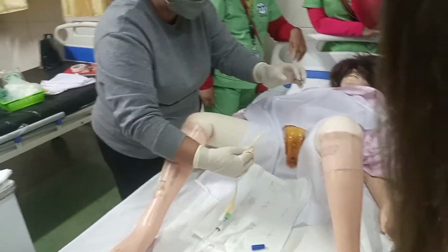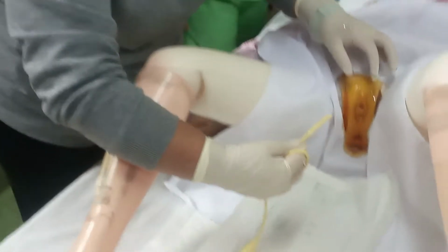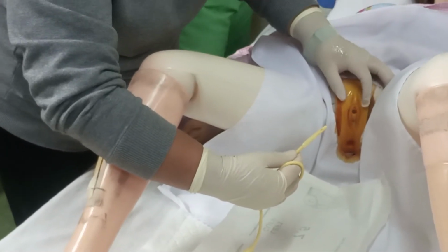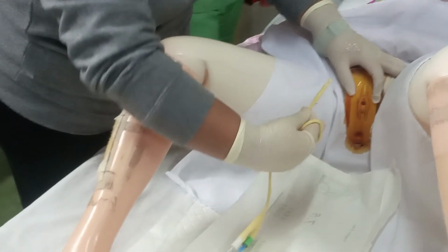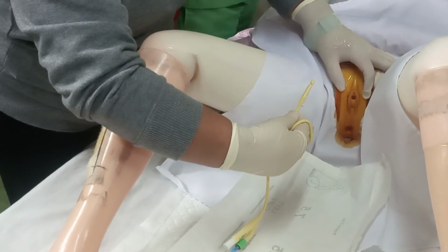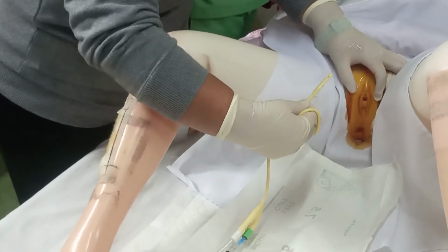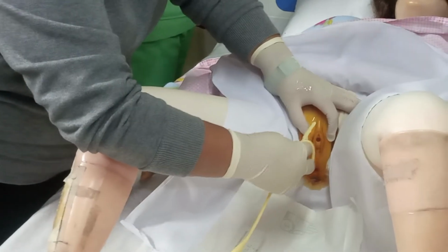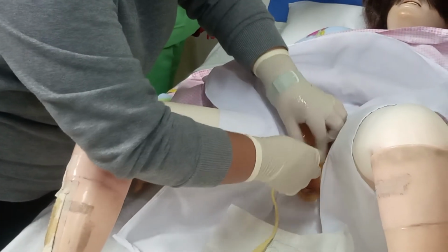Next, you're going to touch and spread. Lola or ma'am, I'm going to touch your perineal area and I will spread your labia majora para maipakita niya lahat ng nasa loob. Okay? So, tignan mo kung nakita mo. Pag nakita mo na ready ka na may place na to insert, then you say, Lola, at the count of 3, I will insert the catheter. Please inhale and hold your breath for your vaginal muscles to relax. 1, 2, 3. Then, insert.